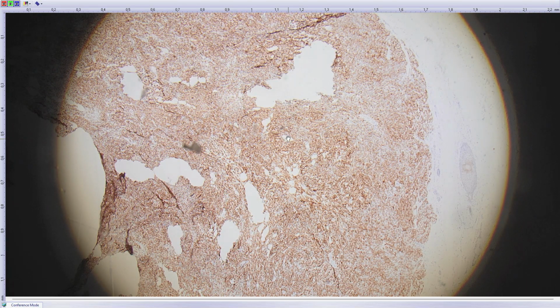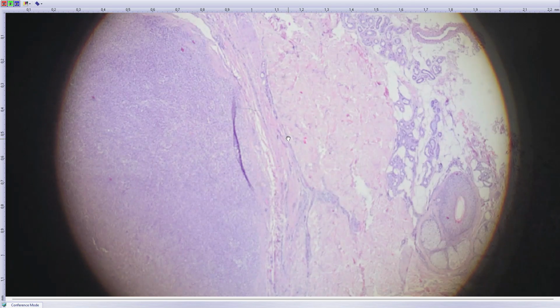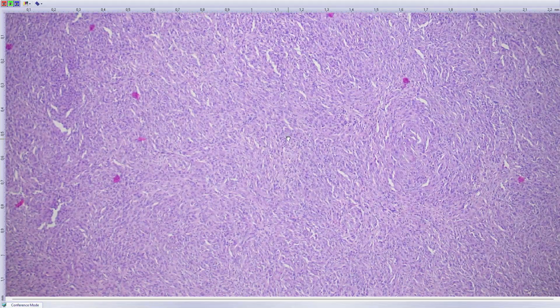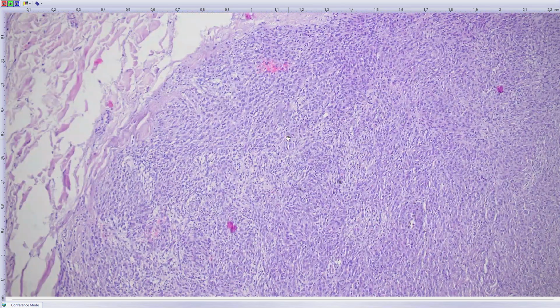So it's a molecularly distinct variant of fibrous histiocytoma or dermatofibroma. So again, these are very often sent for consultation. They are pretty common actually, and it's just because people don't think about them. All you need is ALK immunostaining and exclude melanocytic lesion by doing SOX10 and S100, because of course it mimics melanocytic lesions. It's completely benign.